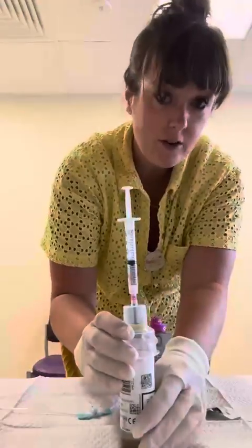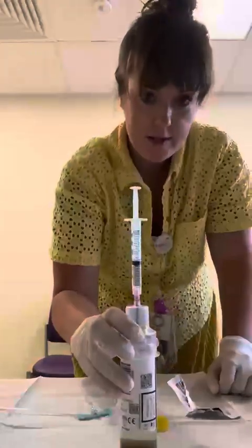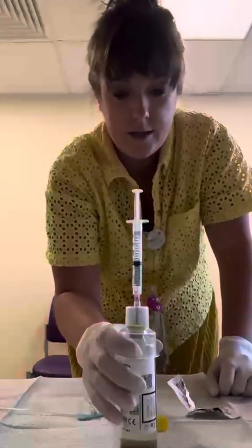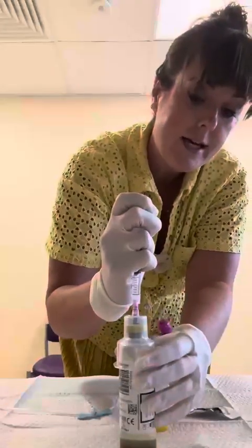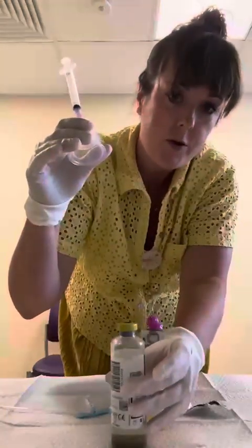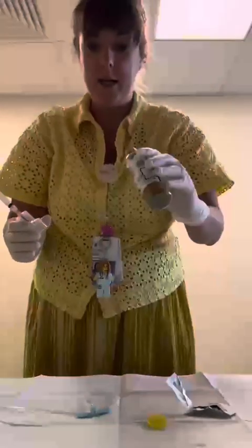So if you had other labs that you drew, the culture needs to be obtained first. That means you stick it in here first. But if you lose track of yourself, you might just let it all get sucked in. So you either have to let the syringe go in really slowly with your hand on the plunger, or you can be watching it and grab it out before it goes all the way in. You're going to oscillate this about 8 to 10 times to get a good mix.